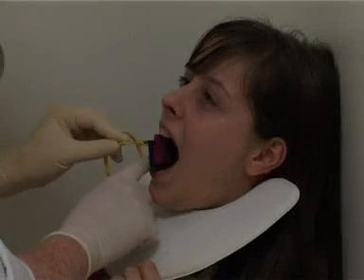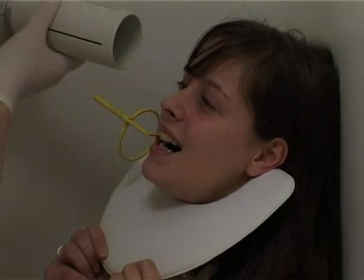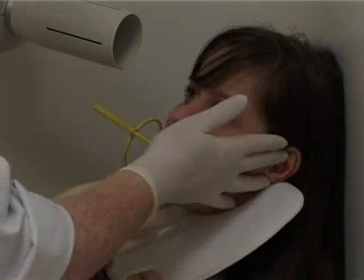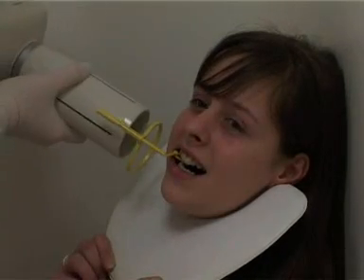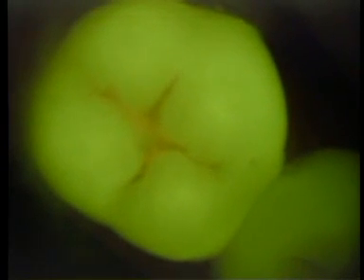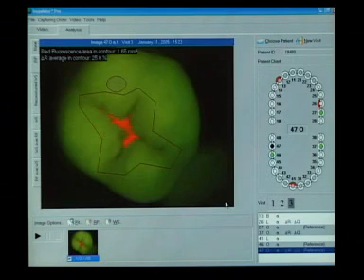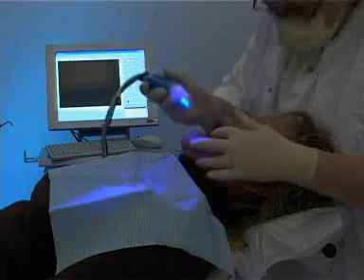The latest revolution in caries diagnosis — the x-ray — still plays a major part in daily professional dental care. QLF adds a whole new field of diagnostics by detecting and tracking very early lesions over time and disclosing bacterial activity. The technology can detect many lesions way before they can be detected with x-rays, and unlike x-rays, it can be applied without restraint.